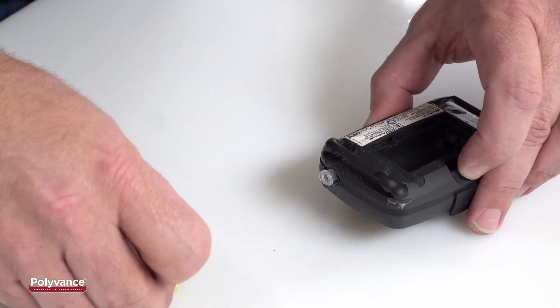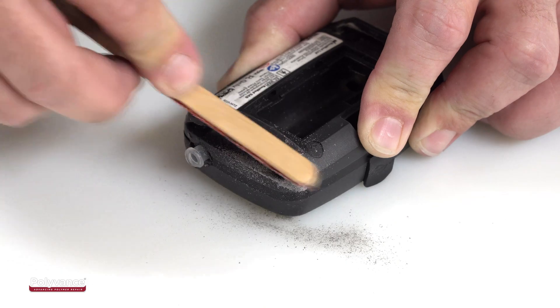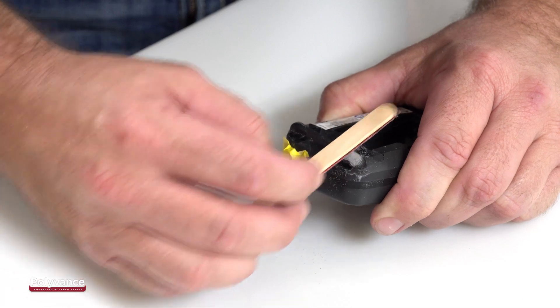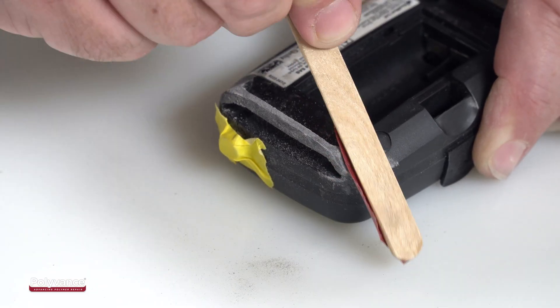If you are not concerned about the finished appearance of the repair, you can stop here, but in this case we want to restore the original profile to the part. This is easy to do by sanding with progressively finer grades of sandpaper. We started with 80 grit, then switched to 180 grit, and finally to 320 grit.